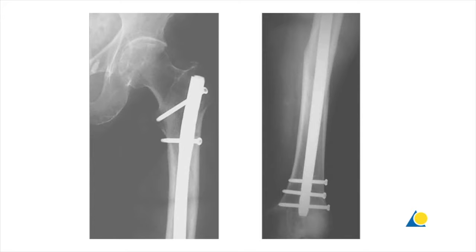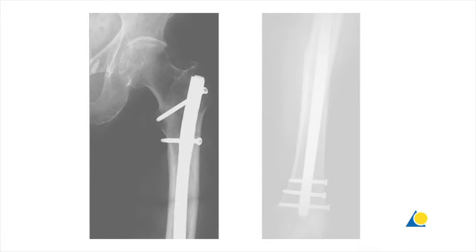The radiographic ruler for nail diameters is placed perpendicular to the femur axis so that the round diameter gauge is located over the isthmus. The nail diameter is selected where the medullary canal to cortex transition is still visible on both sides of the gauge. In a clinical case, two or three distal locking screws and two proximal locking screws would be used for this fracture. In this practical exercise, only the two proximal screws will be inserted.